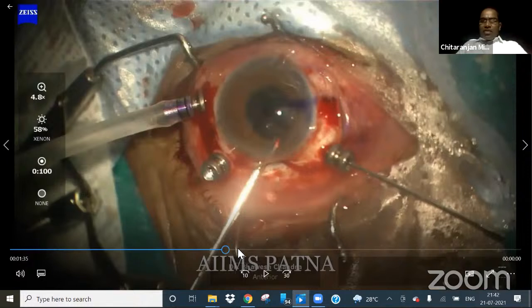Another thing is, all these patients who are coming to us with an IOL drop, their prognosis and visual potential is very good. It is kind of 6/6 or 6/9 cases, all these cases. So we cannot afford to make any breaks or anything in that. PFCL actually helps by giving a cushion by which the disc and macula are protected, and we can easily remove it. And regarding what Dr. Abhishek told, sometimes it slips, but with a slight maneuver or putting one or two more bubbles of PFCL, we can easily bring it above the PFCL surface, and then we can make it vertical and bring it to the pupillary plane.